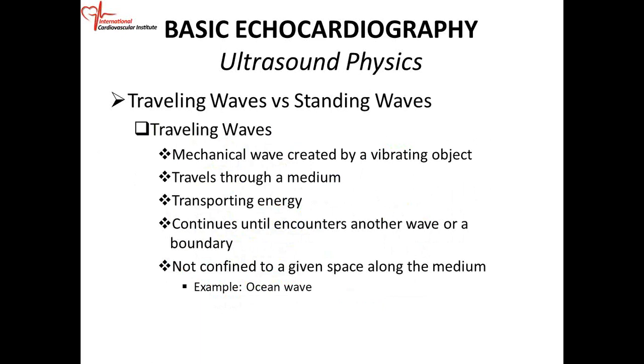We did Doppler in detail, and we said that when we do ultrasound, we talk about the blood now. If the blood is moving, or any structure is moving towards the transducer, it's going to give you a signal above the baseline. If the moving structure is moving away from the transducer, it's going to give you a signal below the baseline. So we went into that in detail, and I think you understand that.